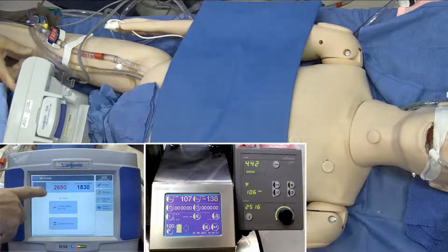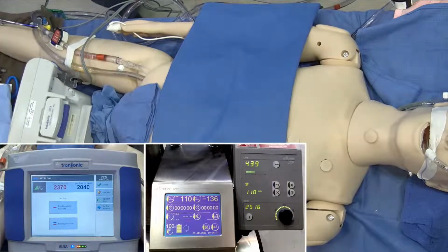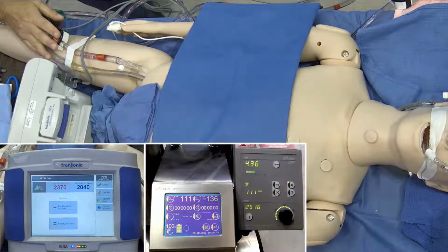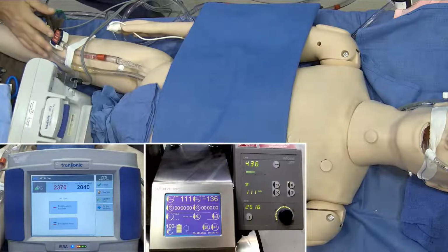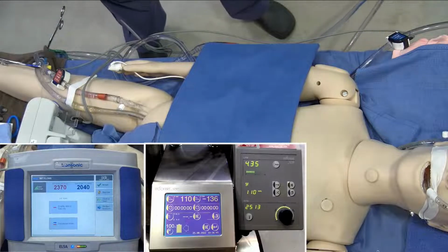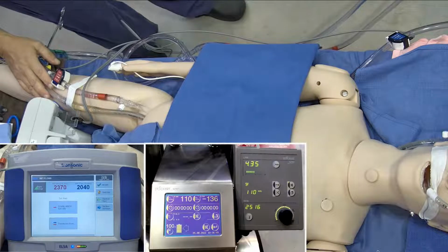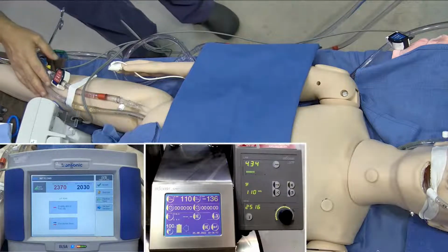And you can see this has dropped slightly, that has increased slightly, but our total flow has remained essentially the same. Now, if I didn't have the benefit of these flow probes, what I would have to do is remove the flow probe that comes with the ECMO circuit and choose which one of these arms I wanted to measure, or both, and then go back there.